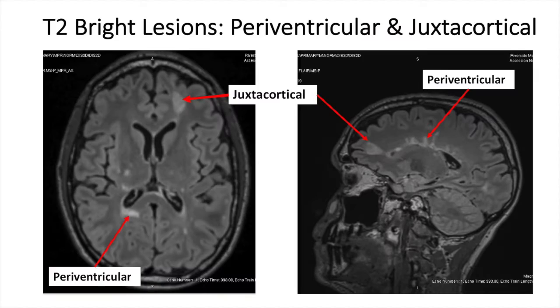Let's take a look at a couple of examples. T2 bright spot or T2 hyper-intense lesions typically occur in MS in four locations, which I'll show you with these MRIs. Here you see a periventricular lesion. Periventricular lesions touch the ventricle — that black structure in the middle — and the lesion must be touching it in order to be called periventricular.